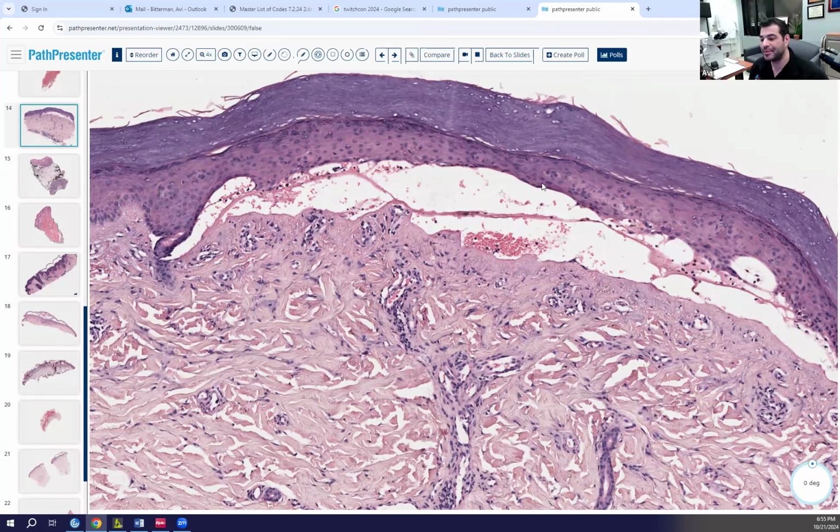Cell-poor BP is n-serrated, yes, correct. And EBA is u-serrated. Okay. And you can also do ELISA.